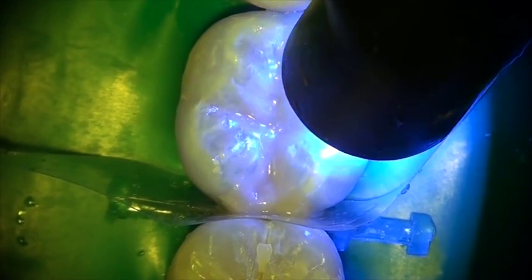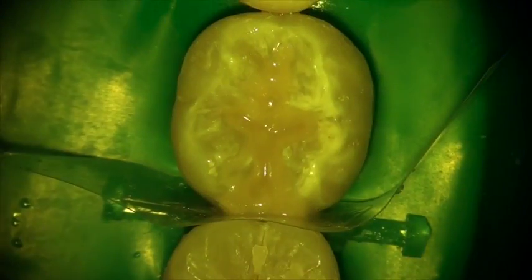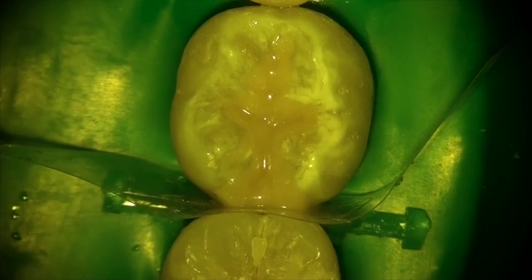So there you have Equiaforte Bulk Fill Fluoride Releasing Restoration. This is Dr. Randy Shoup for GC America.